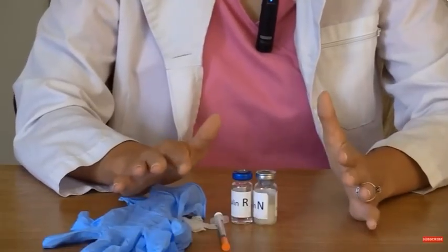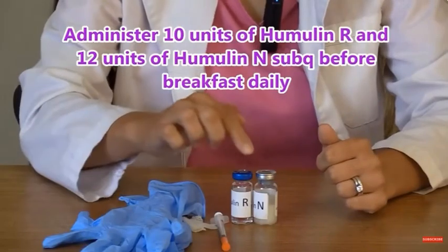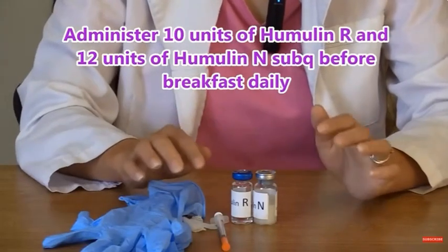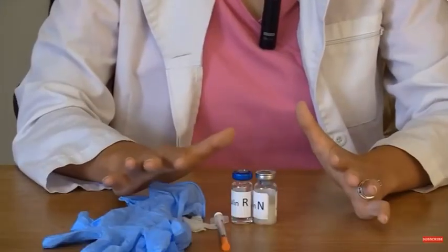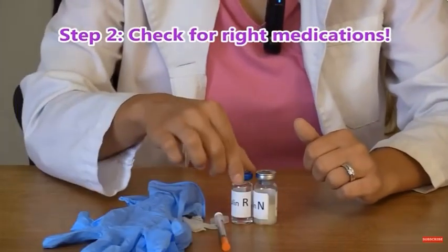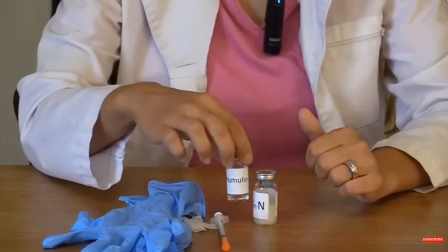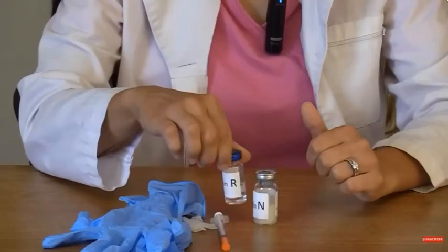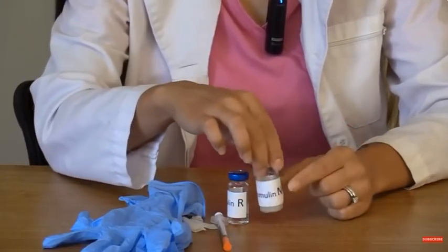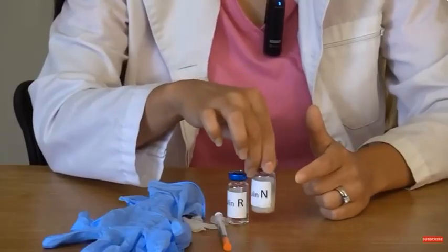Our doctor's order says administer 10 units of Humulin R and then 12 units of Humulin N sub-Q before breakfast daily. After you confirm that, you want to make sure you have the right medications. So you're going to take your vial and read what's on the vial. Here we have Humulin R, and you can tell because it's a clear solution. And then we have our other vial, which is Humulin N, and you can tell because it is cloudy.